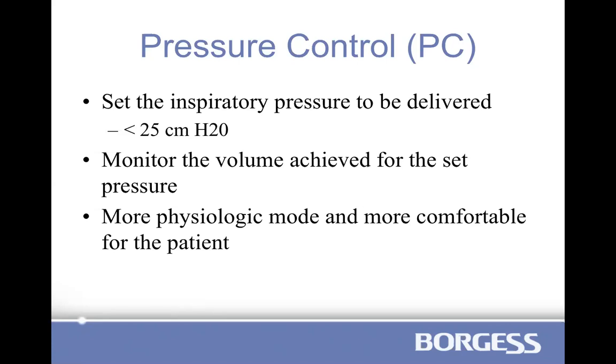If you have a patient struggling on a volume control, it's because I don't take the same volume of breath every single time I breathe. It is uncomfortable to force more air into a patient than they wanted. Pressure control is sort of how our lungs work anyway, based on negative pressure, and it is seemingly more comfortable for the patient. But you do have to monitor to make sure they are having adequate volumes achieved based on your pressure, because you still need to have adequate minute ventilation and adequate gas exchange. But that's the concept behind pressure control.